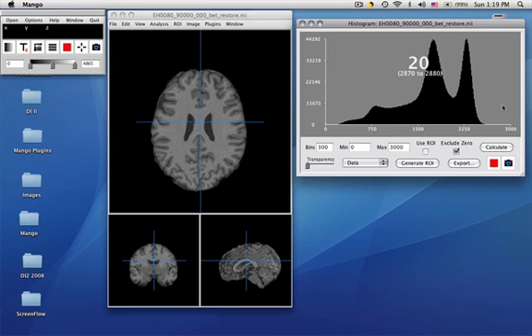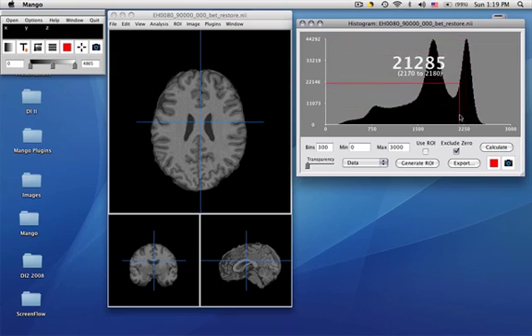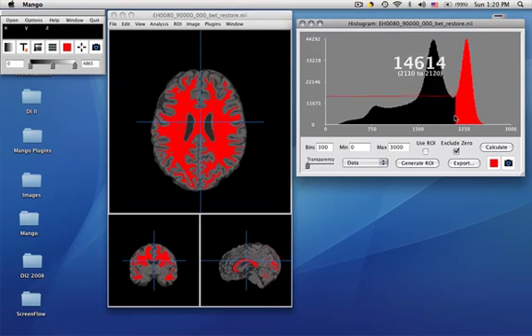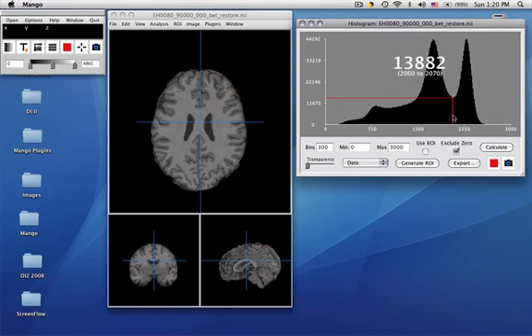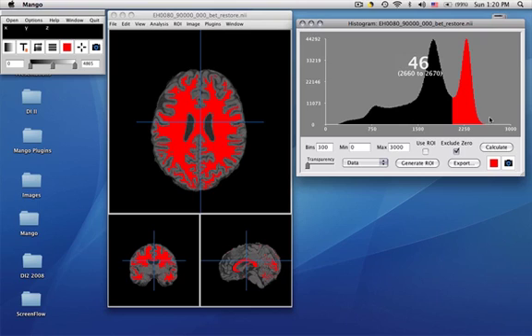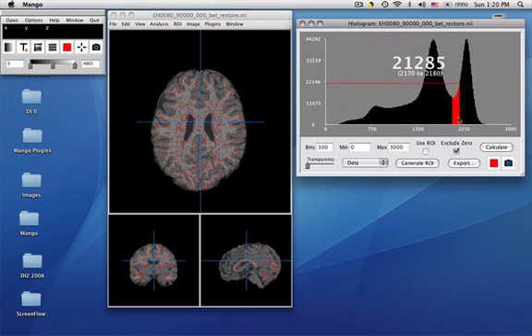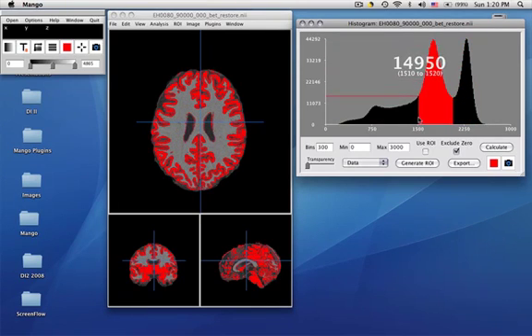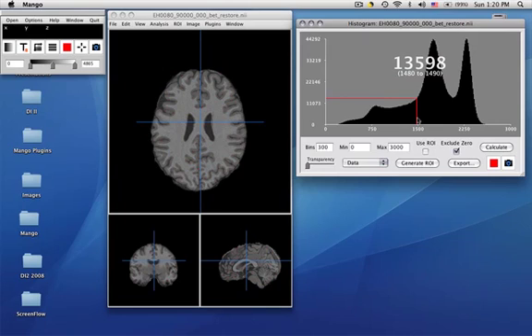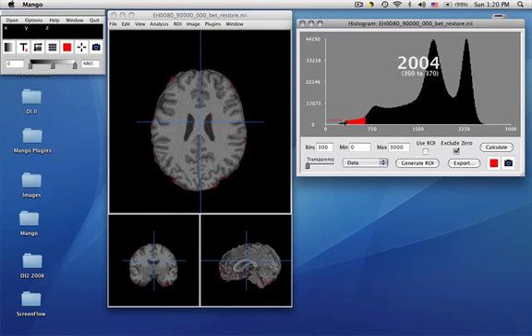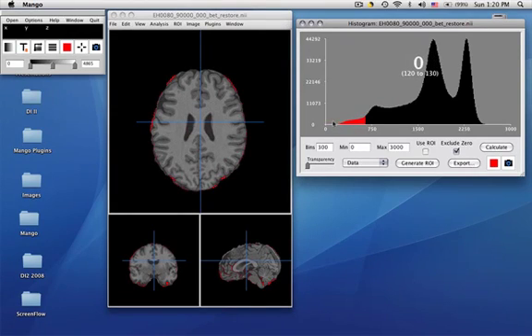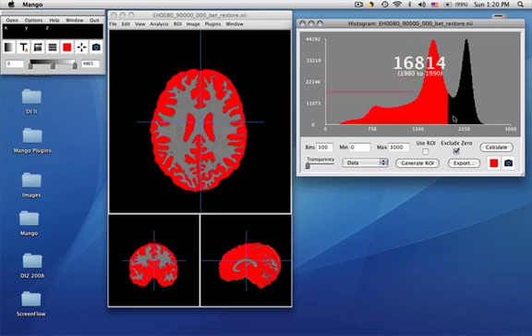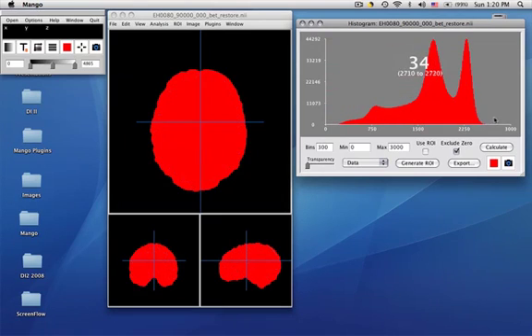Another way to highlight is to move the cursor to a starting point, for instance here. And press the shift key, set the anchor, and press the shift key, and you can drag to highlight. In this case, we highlighted white matter, and then we can drag this way and highlight gray matter. If we set the anchor again, we can shift and move over here. And we might be interested in what was this stuff right at the end. It looks like it's mostly out at the edge of the brain. And then we pick up CSF, pick up gray matter, pick up white matter. Now we've highlighted the entire image.